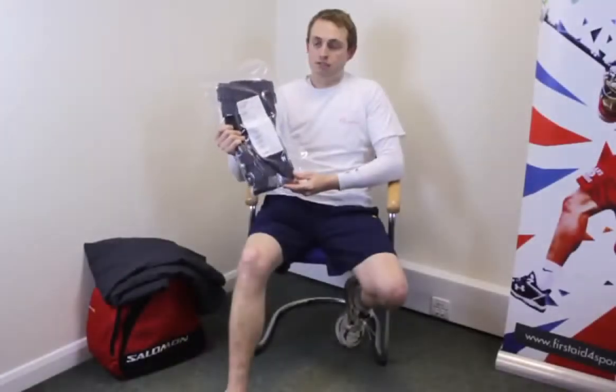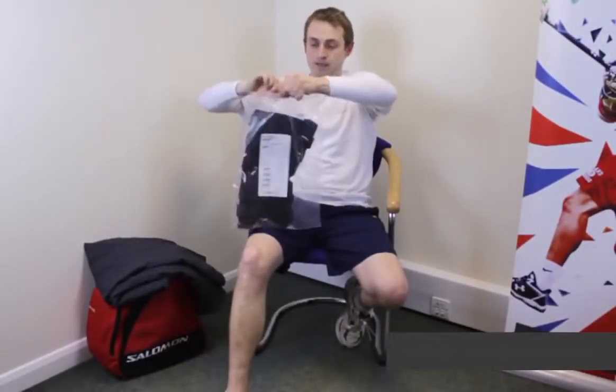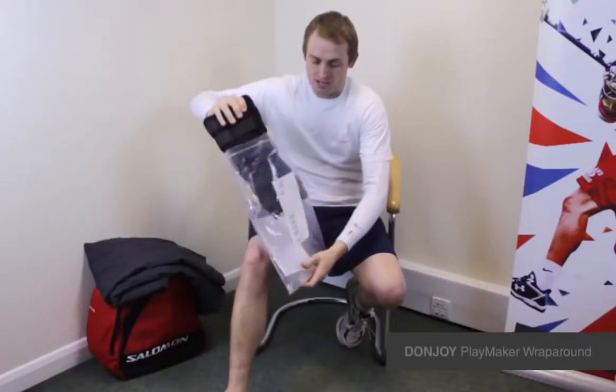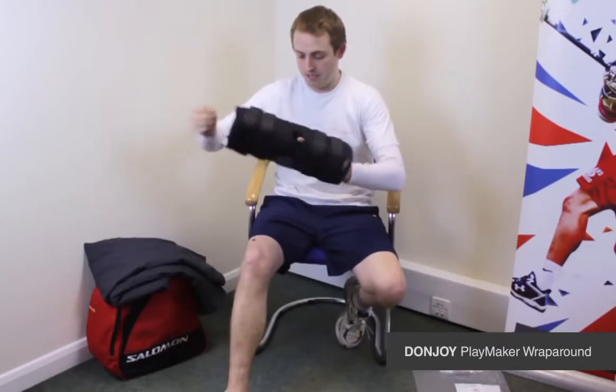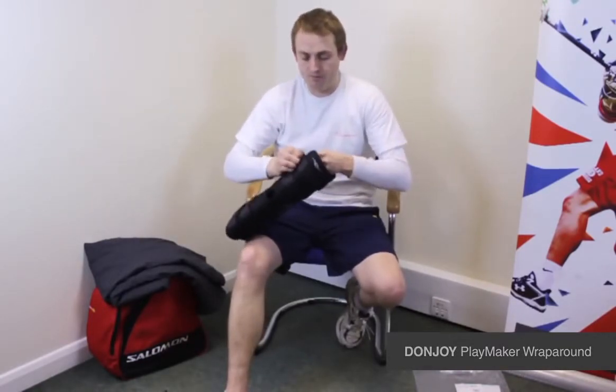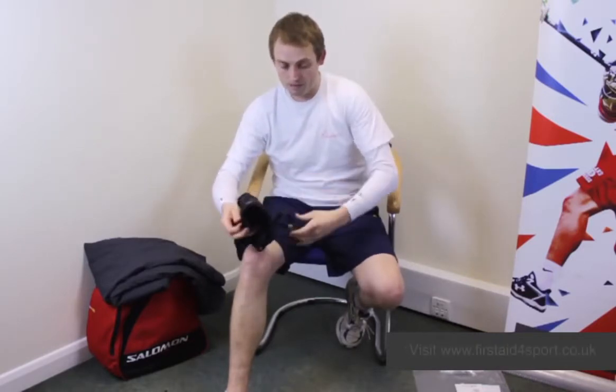I'm Michael Davison, Managing Director of First Aid 4 Sport, and this is the Donjoy Wrap Around Playmaker. Same principle as the normal Playmaker, but this one allows easier application by being a wrap around.